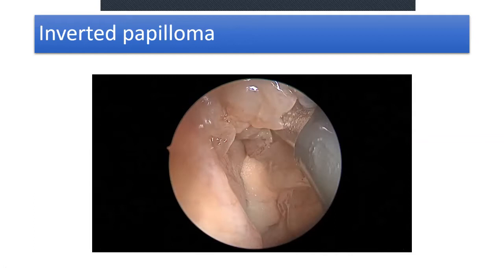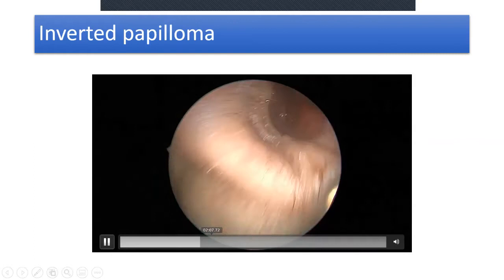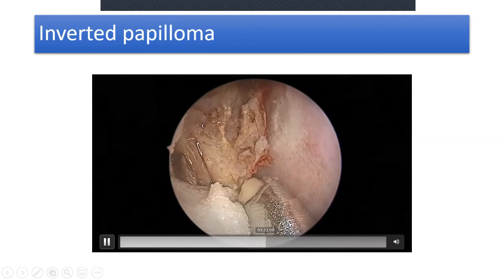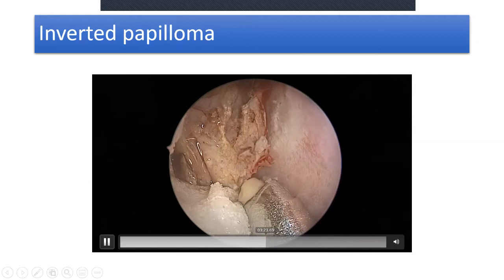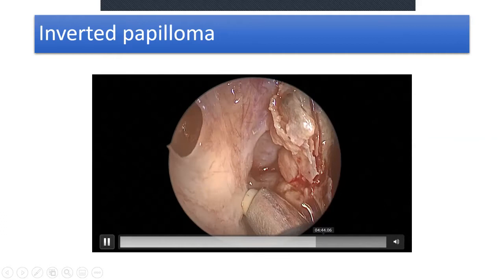Going toward the end to cut off the middle turbinate where the inverted papilloma appears to be arising from — based on neo-osteogenesis or hypertrophic thick bone seen on CT. Once that is done, we perform a classical medial maxillectomy — using a medially based flap, drilling and removing the medial wall as much as possible, cutting the nasolacrimal duct sharply with a blade, and using a burr to clear it off.